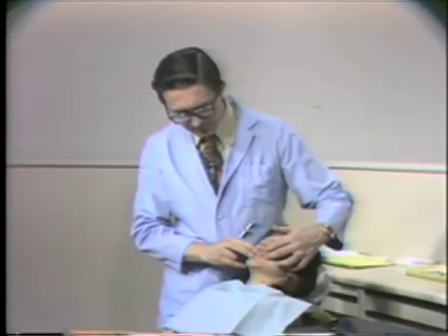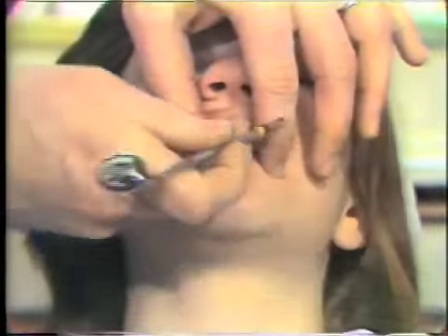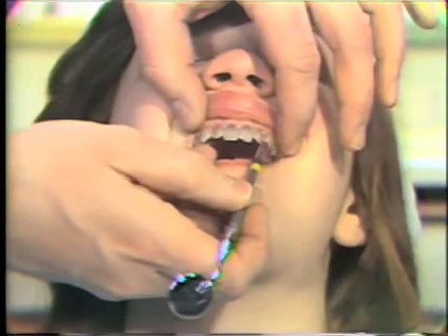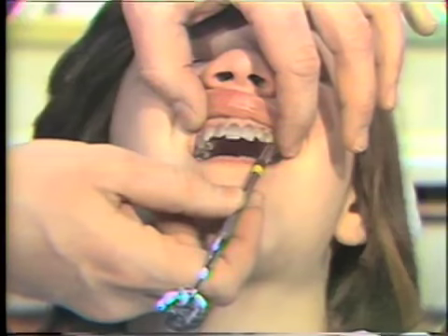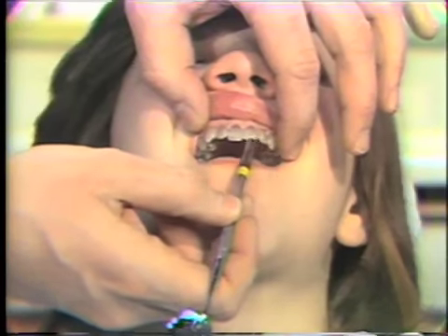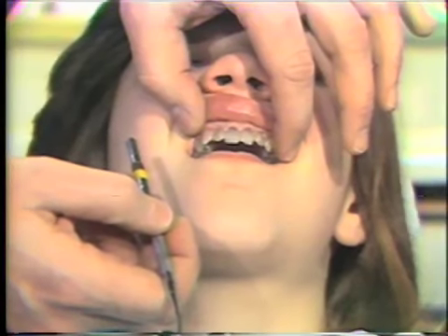First, we do an oral examination. We like to look at the teeth and make sure that there are no restorations on these teeth, and that there are no cracks or crazes on these teeth, through which the superoxol might go and produce irreparable damage to the pulp.